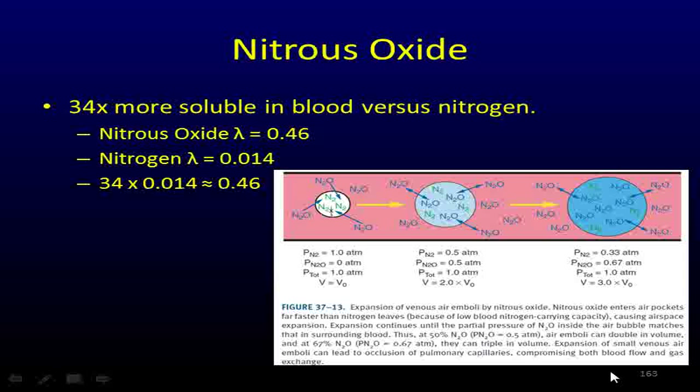Now, if you're in someone else's OR, maybe they turn on the air to decrease the FiO2 delivered to the patient, because you may have heard about oxygen toxicity over hours and hours. Some people do not like to run a very high FiO2. Well, I solved that problem: 50% of my mix is usually nitrous oxide, and the other 50% is oxygen, so I have a lower FiO2. But I want to fill up all of my spaces with oxygen. So what do I have to displace? Nitrogen.